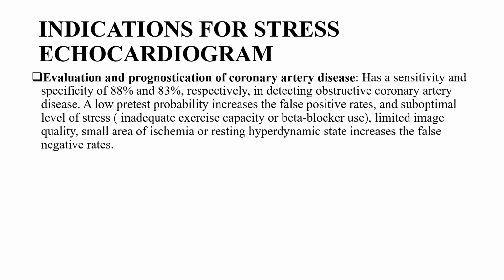Evaluation and prognostication of coronary artery disease. That was the main reason for stress echo. It has a sensitivity of 88% and a specificity of 83% for obstructive coronary artery disease.